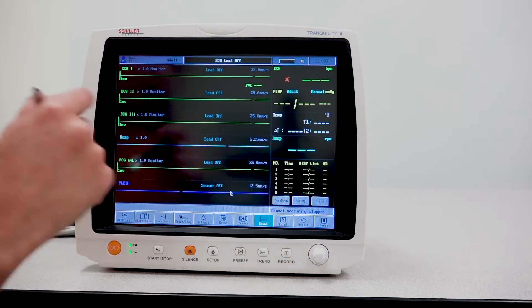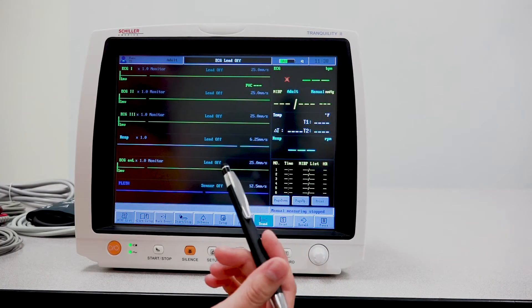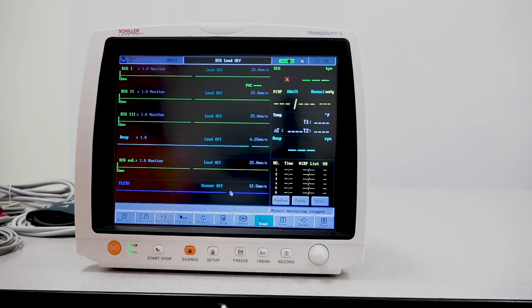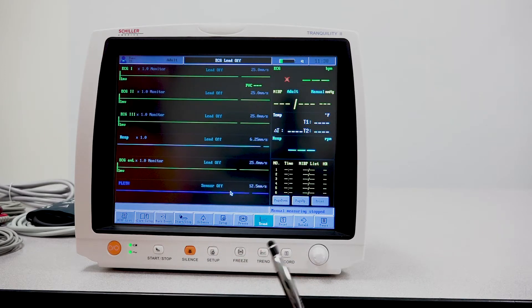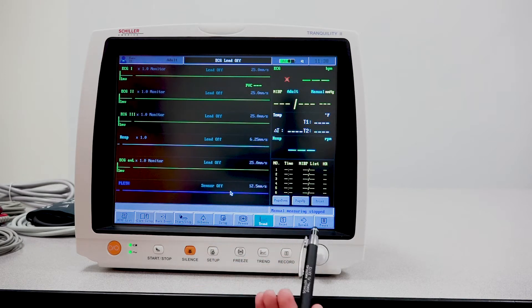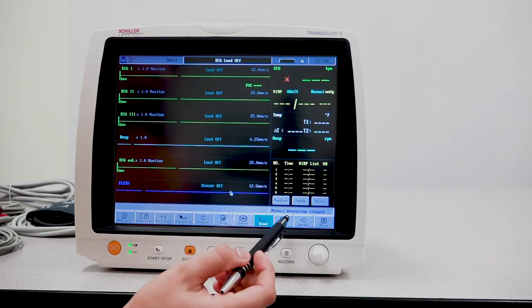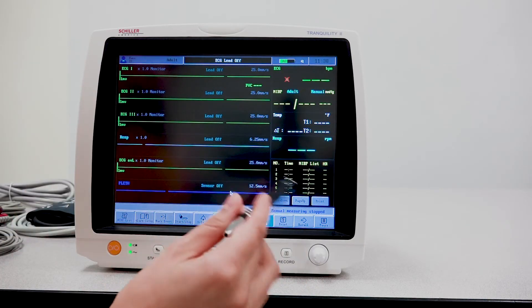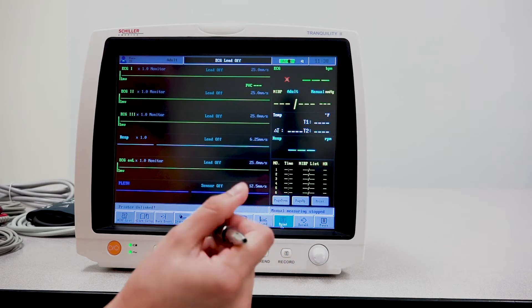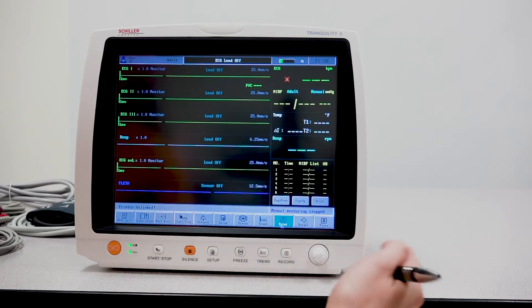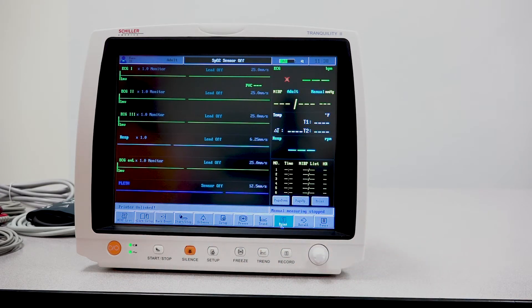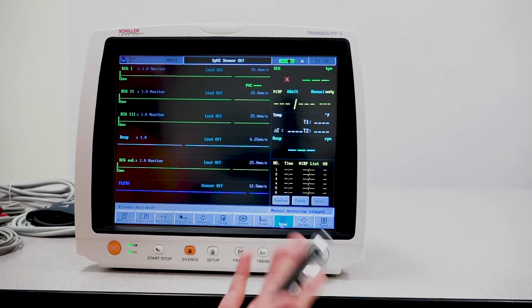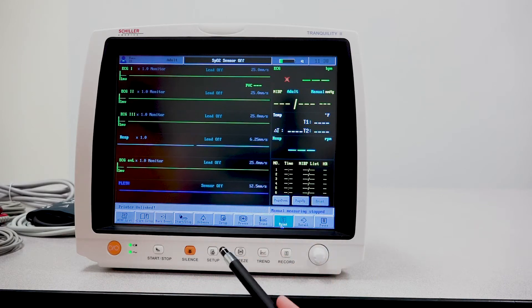As I mentioned earlier, this unit does have the ability to have an internal thermal printer. If you did have that option, you can easily press print. Once you want to print your report, you'll press print and eventually your report will print out. This unit doesn't have it, so we won't see anything.